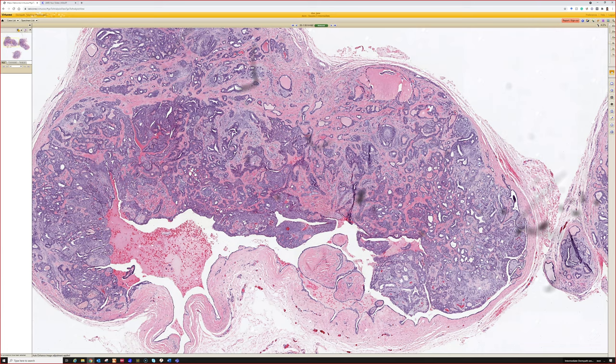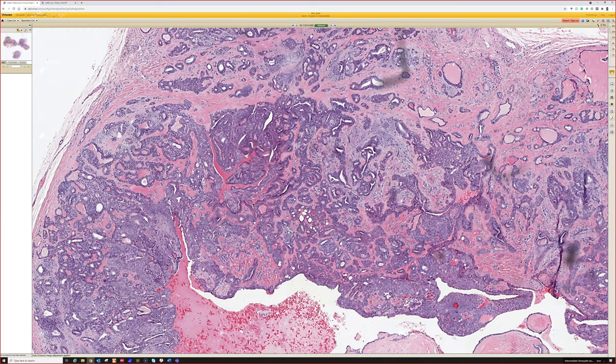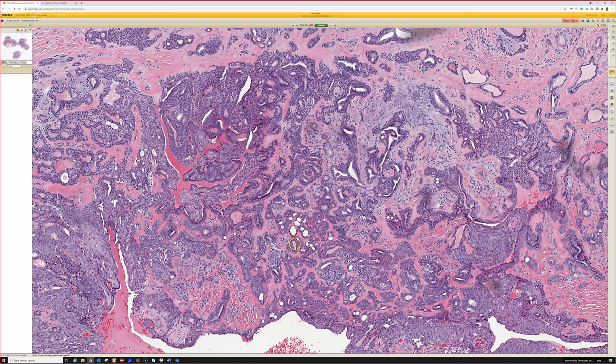But again, in real life, I don't really focus on sorting that out, but I do think probably biologically there really are two different groups. I just think it's hard to tell. But the reason I point that out is sometimes you'll see tumors that defy the rules, and you'll see a thing that has sweat ducts but also has obvious hair follicle differentiation. And how do you make sense of that?